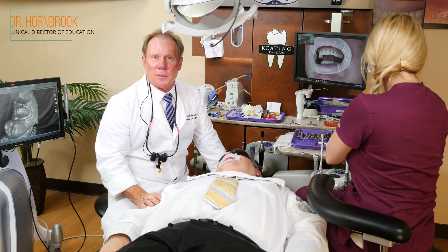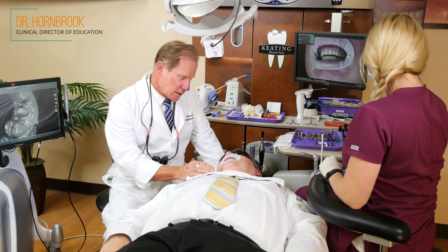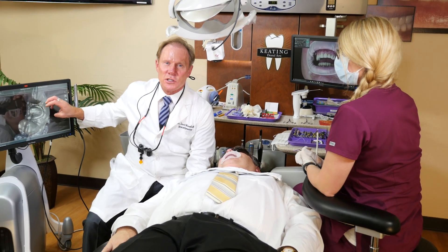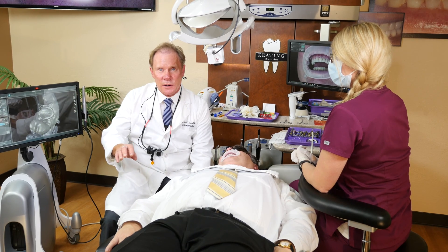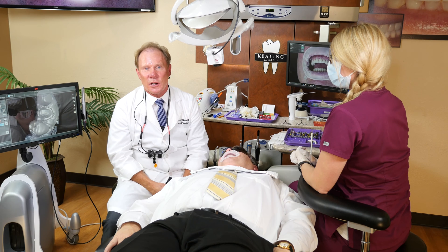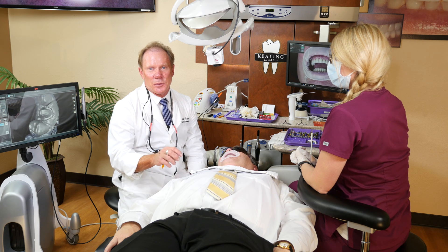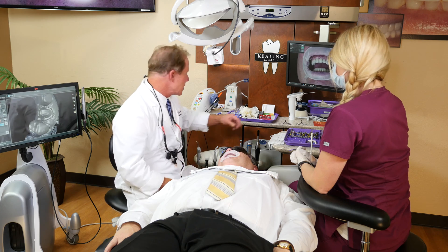We're back for our second visit with Kim. As you recall, we took a digital impression for the maxillary left canine. The nice thing about digital is our ability to blow up the margin and see it visually. This gets modemed to the laboratory and they make a virtual model and fabricate the restoration on the virtual model. At this point we don't have a physical model, but here at Keating we have the accuracy that we really don't need one. Let's check it here to reinforce that.